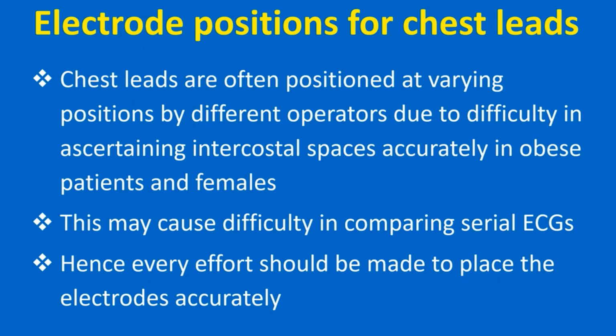Chest leads are often positioned at varying positions by different operators due to difficulty in ascertaining intercostal spaces accurately in obese patients and females. This may cause difficulty in comparing serial ECGs.